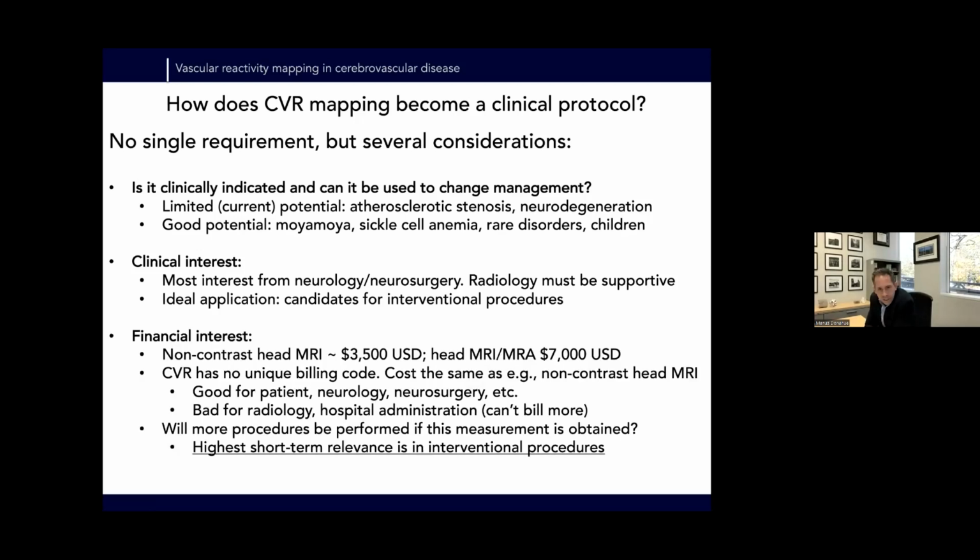There are also financial interests. For people that are starting out in this field, it's interesting to know some of the numbers behind these scans. So in the United States, and I think most Western countries are similar, a non-contrasted head MRI costs about $3,500 US.